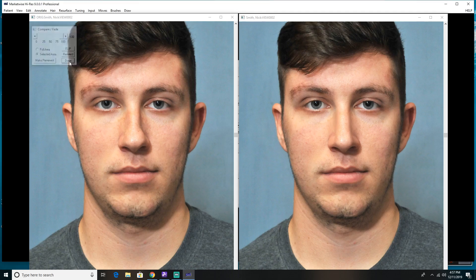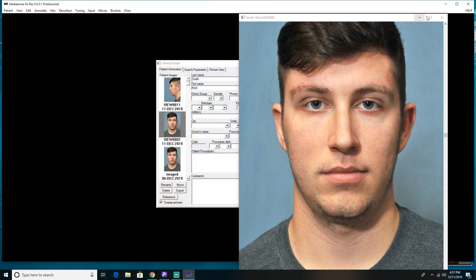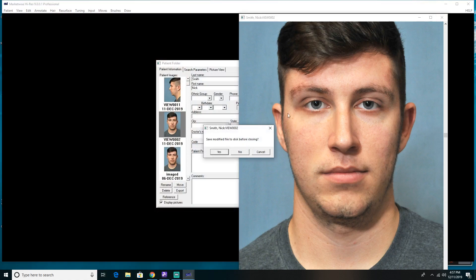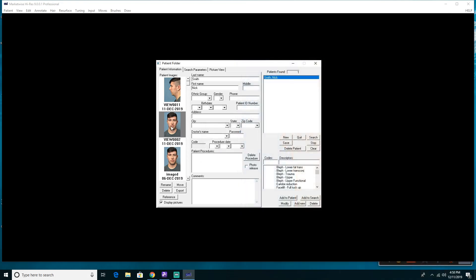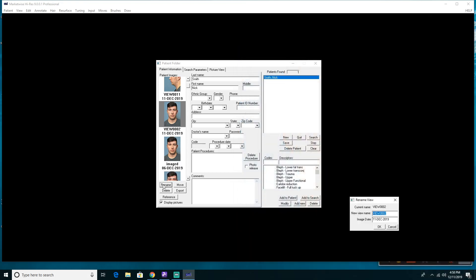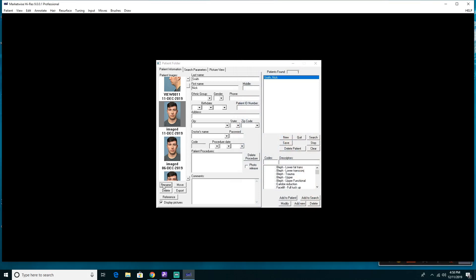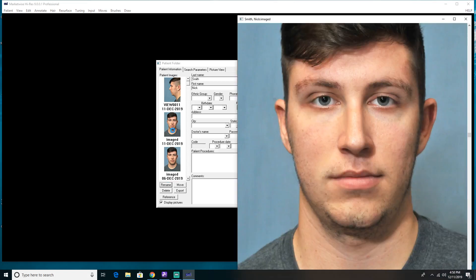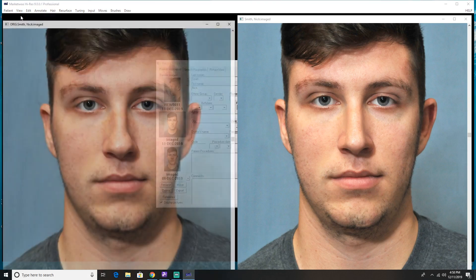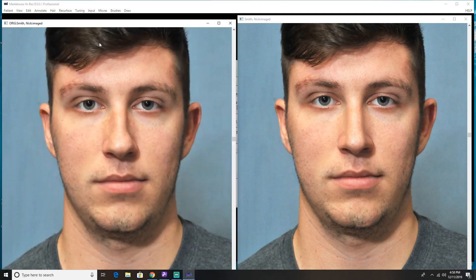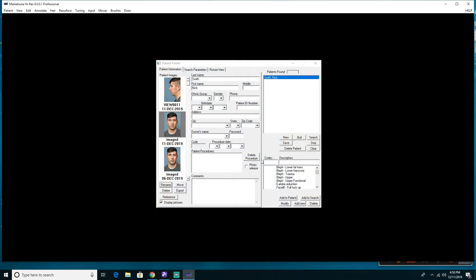Let's go ahead and close the soft compare box and close our original picture. When we close our imaging, it's going to ask me if I want to save my modified — I'll say yes. When it closes, it has saved my imaging. I'm going to rename this picture by clicking the Rename button and name it 'imaged,' so when I go back into this patient's chart, I know this is an imaged picture. I'll still have the original available to me, so I have both the original and the image by doing it this way.